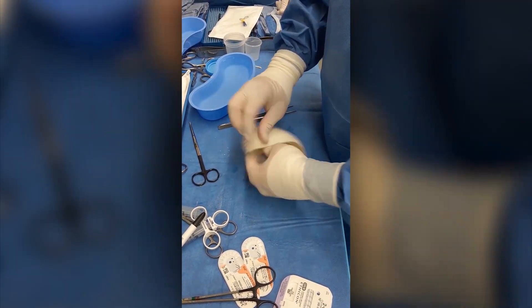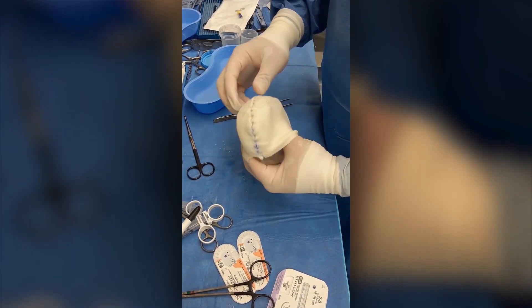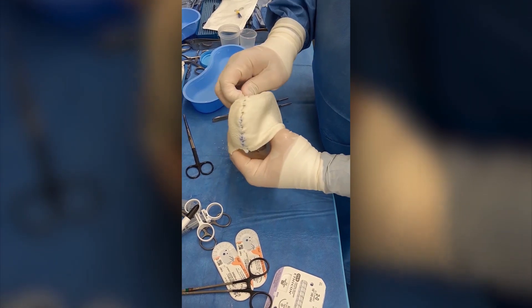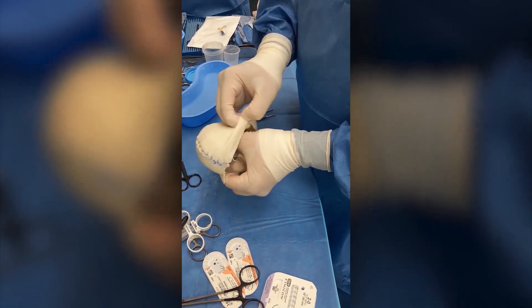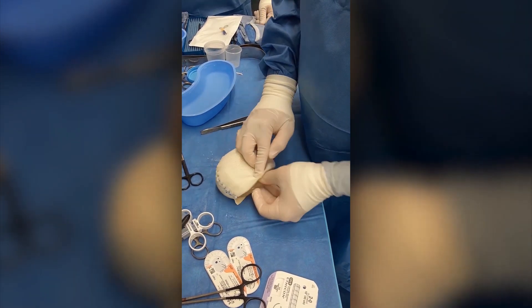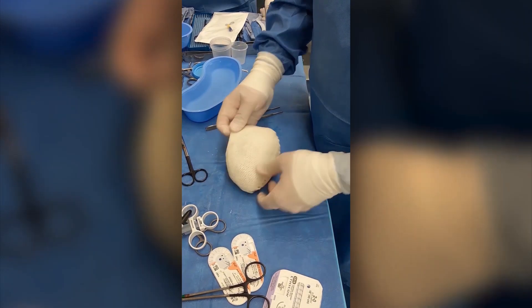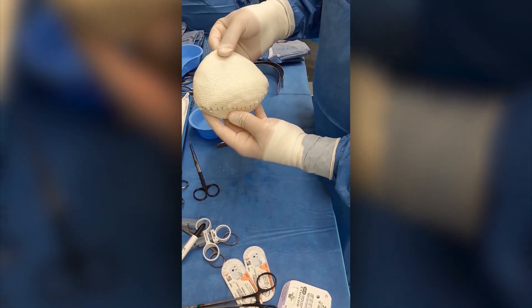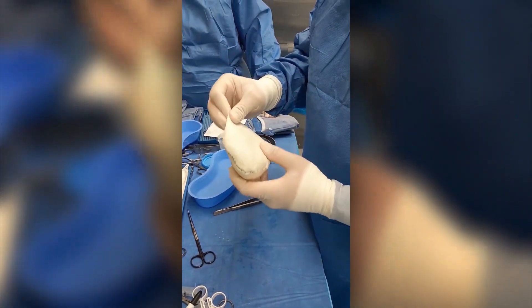First I'll pass it inside and at first it'll look like we only have partial coverage, but I'm going to actually pull this around so that I'm going to cheat the back surface so that I can pull more of this toward the front end. I'm going to use this tab up here — you can see we basically get full anterior coverage of the device, partial coverage of the back, and I'm going to put little incisions here to bring the tabs out.